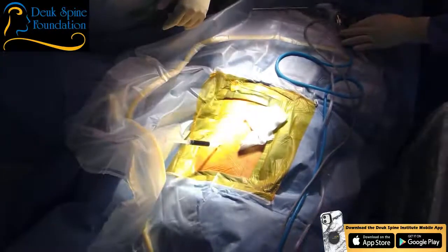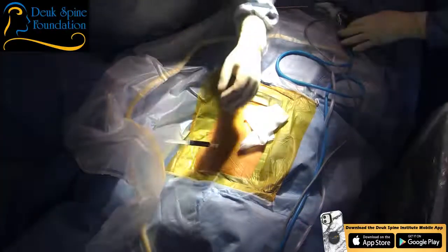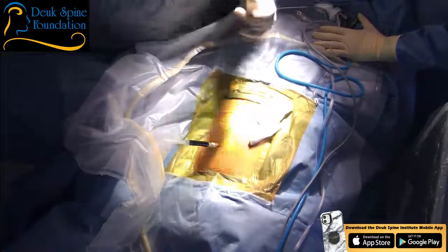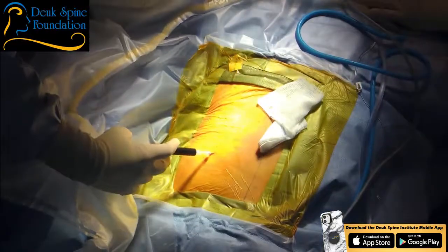And what's wrong? Oh, you just put it on your throat? Oh, okay. All right, so we're going to introduce another substance that's dark into the disc, but it's not the same as a cement, so it's just a dye. Are you comfortable?